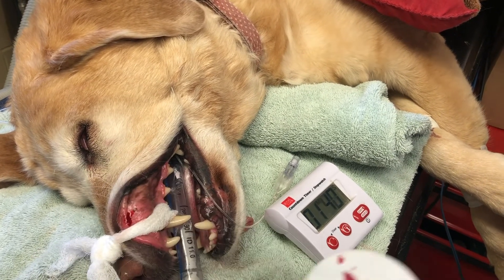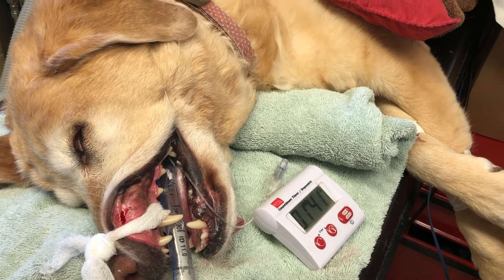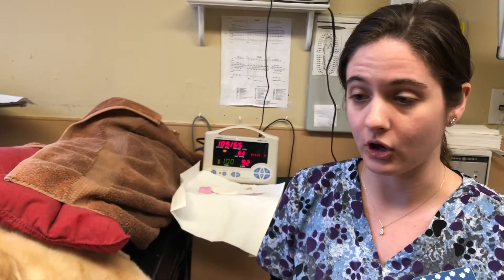Our filter paper has come back clean, so we can stop our stopwatch, and it comes back as 1 minute and 41 seconds, which is normal for a dog, so this patient does not have any platelet dysfunction.